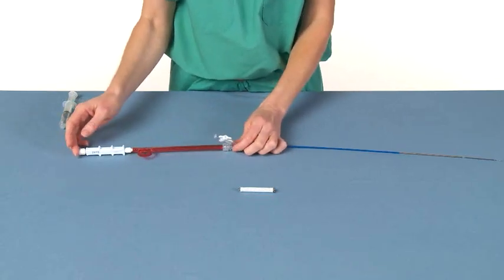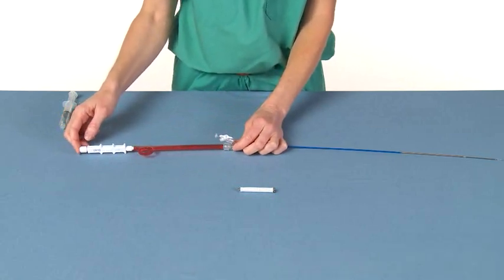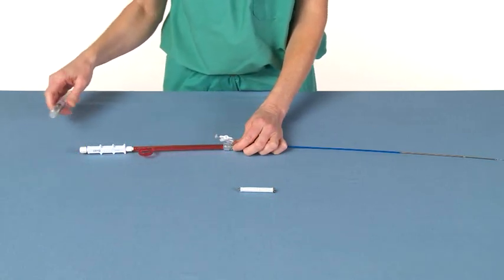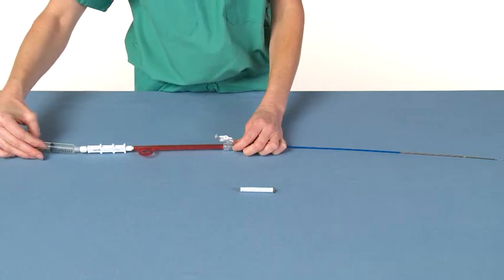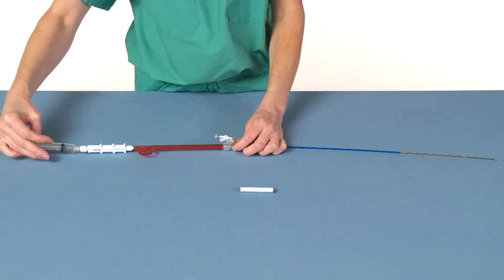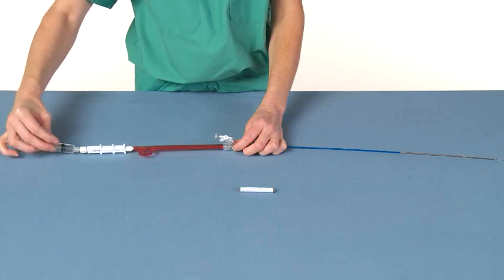Both female luer syringe adapters must be flushed with normal saline before introduction of the delivery system. Flush the inner catheter lumen with sterile saline using a syringe. Flush until saline exits from the tip of the catheter and all air is removed.